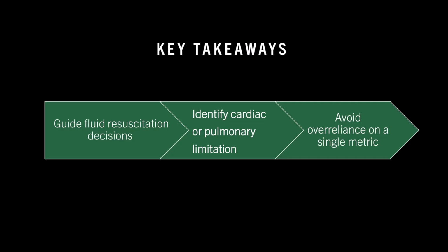POCUS helps us make physiology-based resuscitation decisions. And it can help us identify cardiac or pulmonary limitations that might prevent us from giving fluids, and it helps us avoid over-reliance on a single metric.